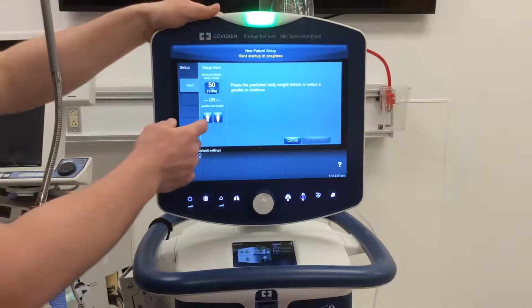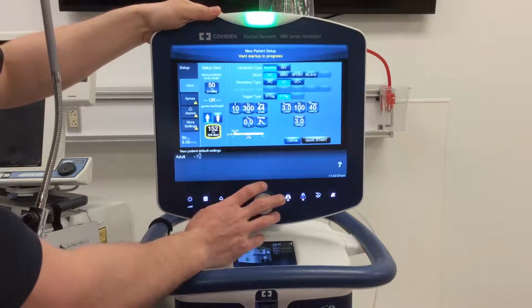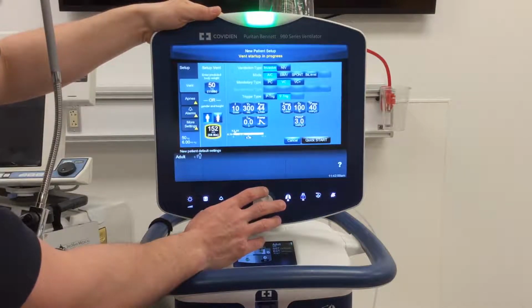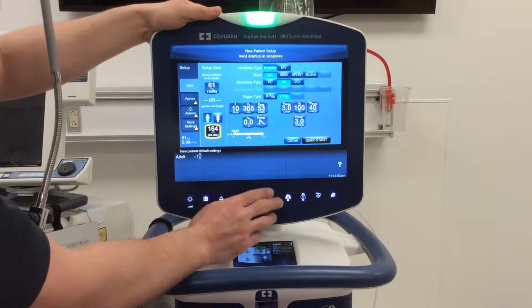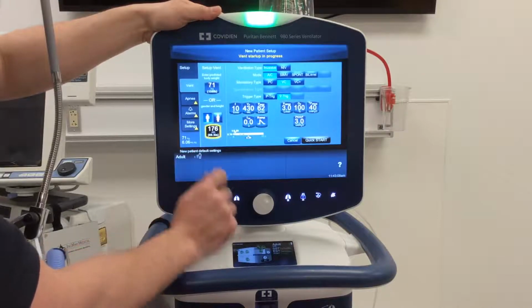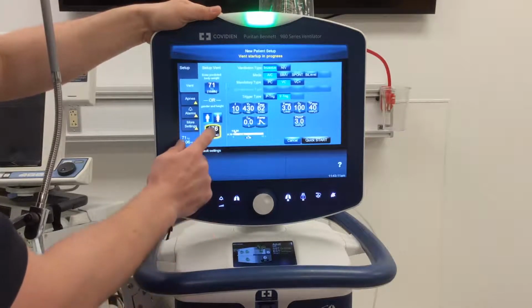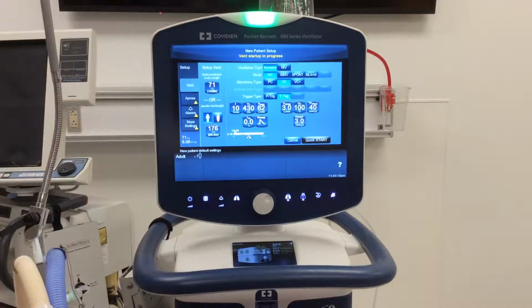So what is really nice, you can choose the gender of that patient, and then you can pull up and pick a height. So we'll say we're dealing with a 5'9" man. You can see it's in centimeters. Most people don't know their height in centimeters here in the United States. So we can scroll through and it eventually brings it up to inches down here on the bottom. I'm going to go ahead and hit that to confirm and lock that in place.